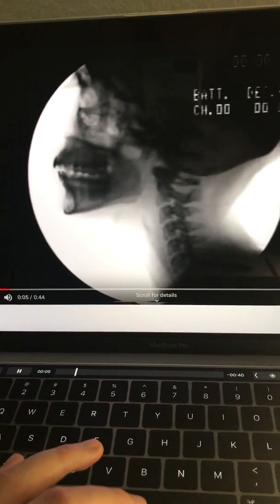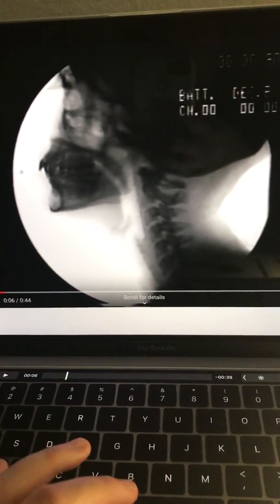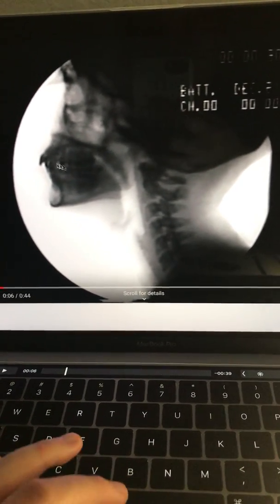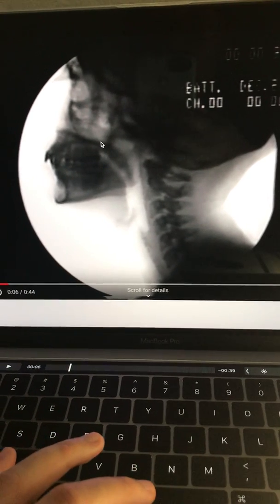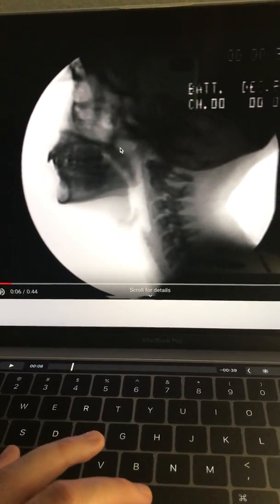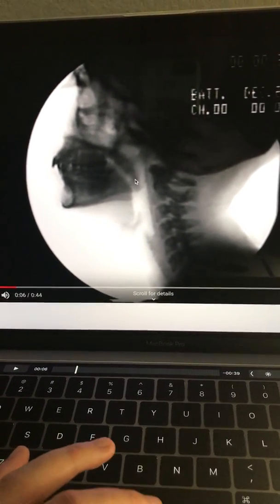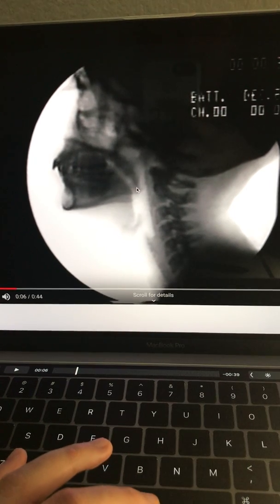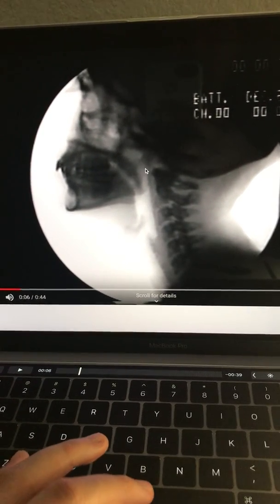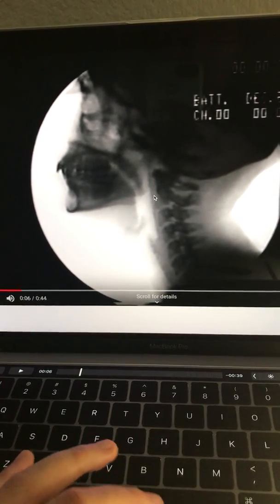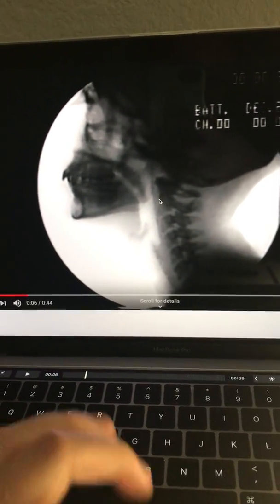After the swallow, we can see the hard palate here with the soft palate, and the uvula hanging down here. When we swallow, this is gonna go up and back to close against the posterior pharyngeal wall.